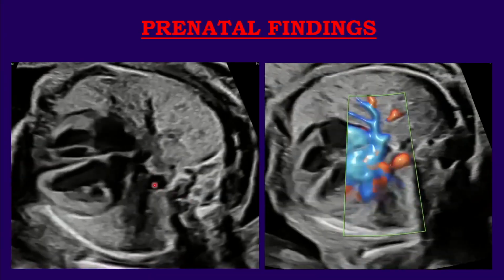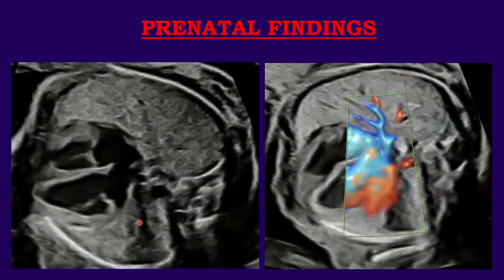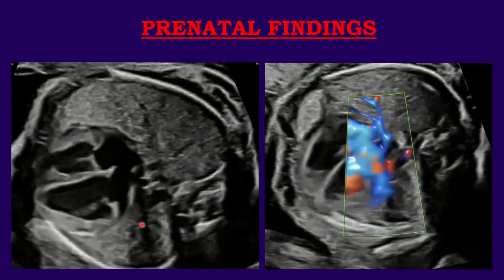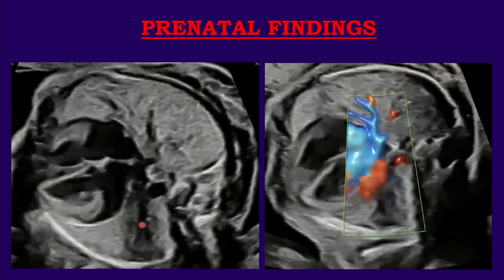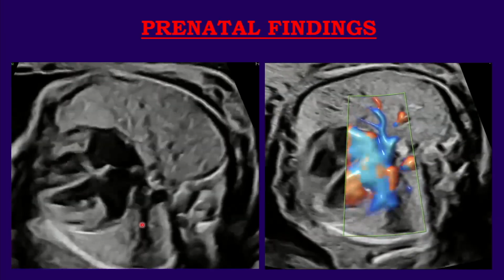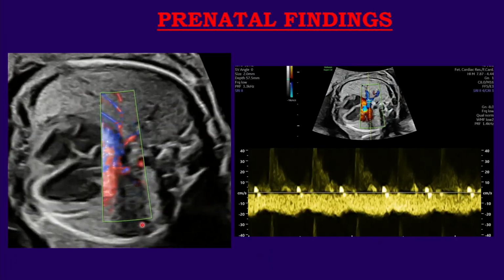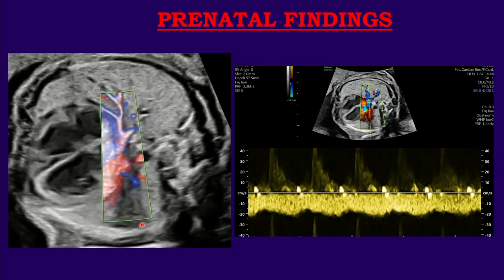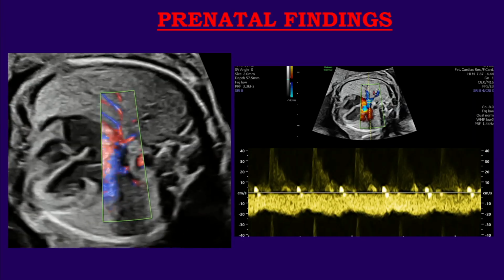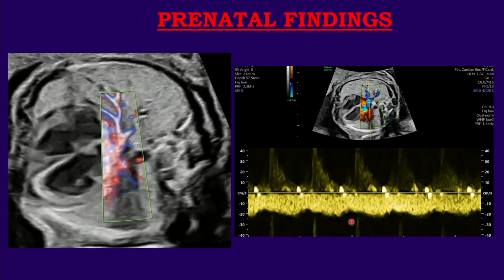So here we have the axial orientation of the 4-chamber view. We can clearly visualize the pulmonary veins, as Tracy highlighted for us that this is the best position of the heart for the assessment of the valves. Do we have more confidence that the pulmonary veins drain normally or not? Probably not. So then we use the more sensitive technique for visualization of the smaller vessels, for microvasculature. Is there any help here? Probably not. But the spectral Doppler definitely demonstrates abnormal blood flow.